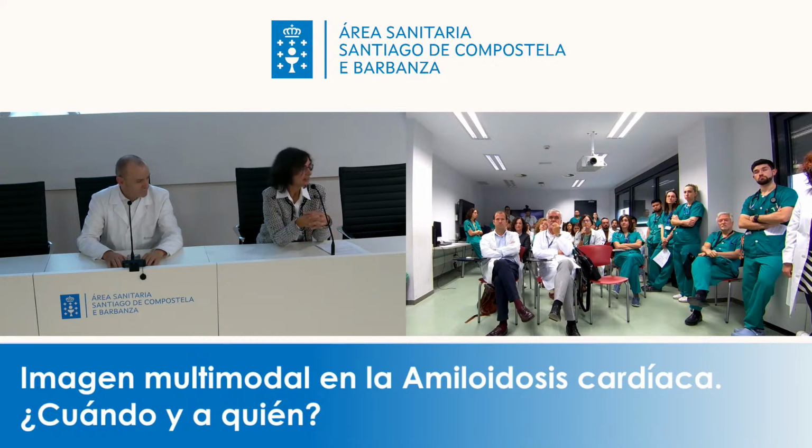También hacemos la cintigrafía para confirmar que no hay la forma ATTR, pero intentamos que todos los pacientes tengan una evaluación completa con eco, resonancia, estudio hematológico, que también es muy importante, y cintigrafía. Intentamos que todos los pacientes tengan posibilidad de hacer todos los exámenes. ¿Cómo hacéis en el 12? ¿Hacéis también a todos resonancia?